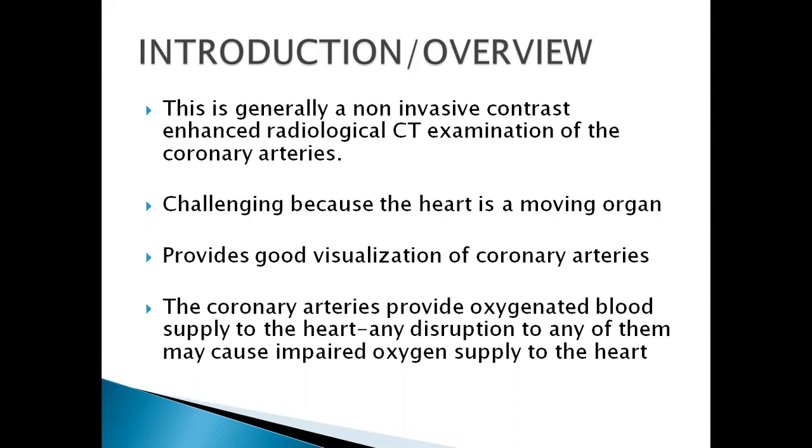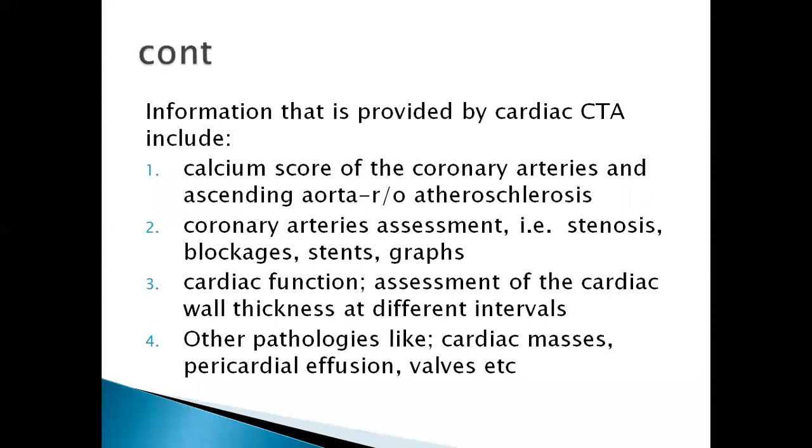So CCTA provides a good visualization of coronary arteries, and we all know that coronary arteries provide oxygenated blood to the heart. So any disruption to any of them will cause an impaired oxygen supply to the heart, which may cause ischemia.